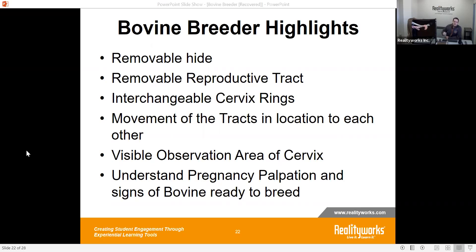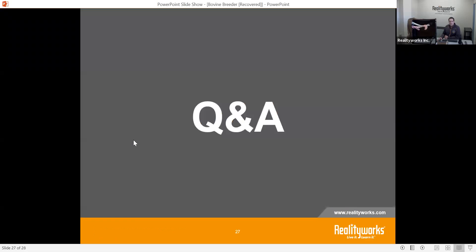There's also a visual observation area of the cervix. Inside the reproductive tract, there's the ability for you as a teacher to see whether the pipette went far enough, whether the AI gun got to where it needed to be, and whether the student is inseminating correctly. It allows students to look inside or not depending on whether the hide is covering it, giving them a better understanding of what's going on during artificial insemination.